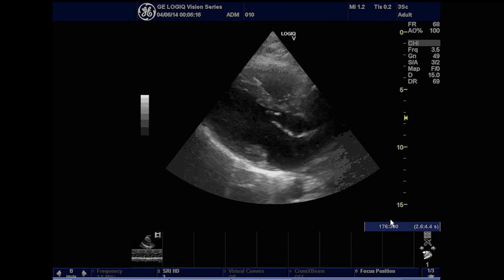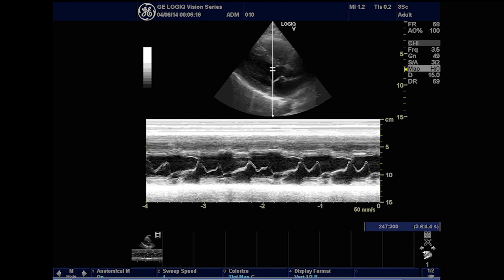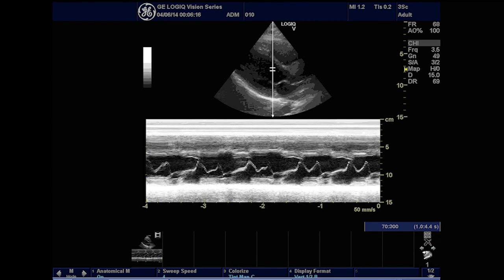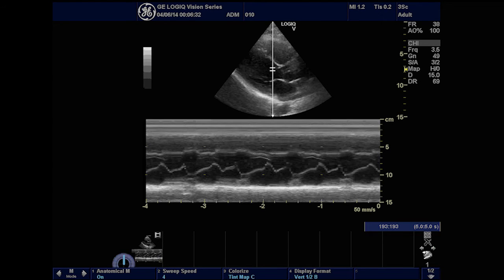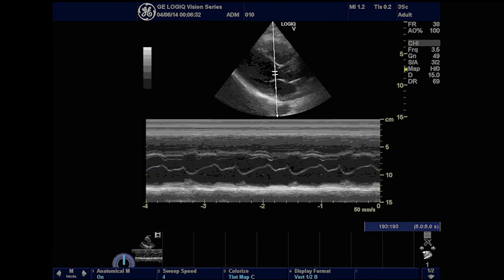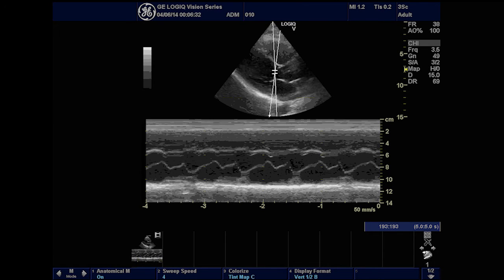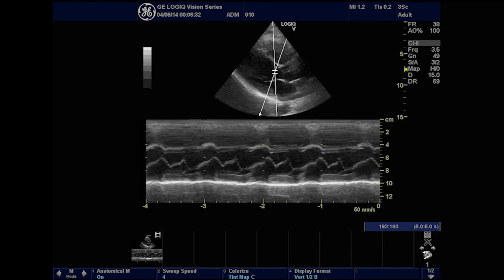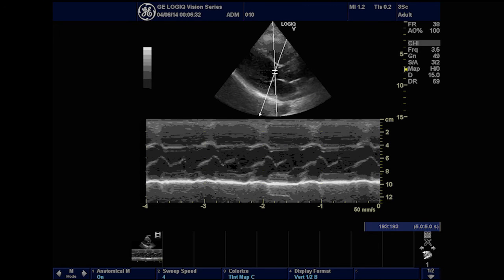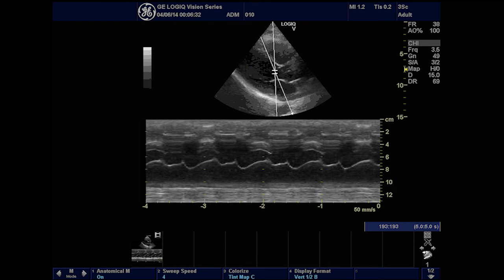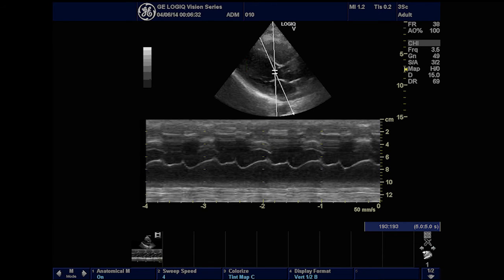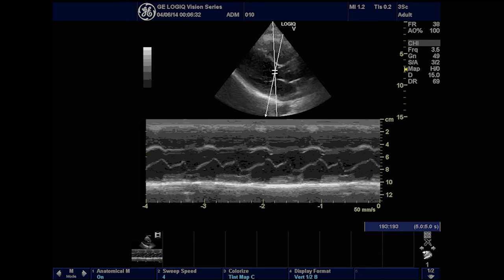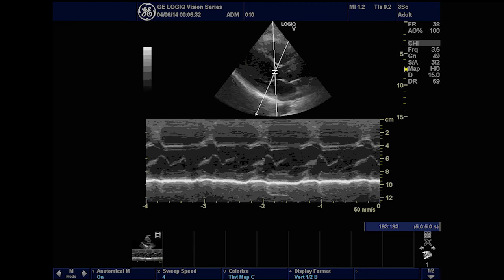The Logic V5 system also supports anatomical M-Mode. This feature enables adjustable M-Cursor positioning to allow angle corrections for accurate measurements. The user can also correct for off-axis orientation when the heart is not positioned or shaped normally. This anatomically correct M-Mode data can be obtained live in real-time mode, or after the scan on a recalled B-Mode Cine loop, because of the storage of the raw ultrasound image data.